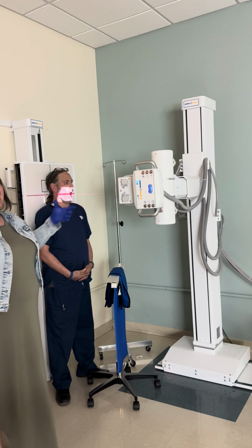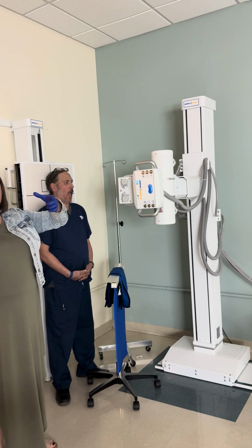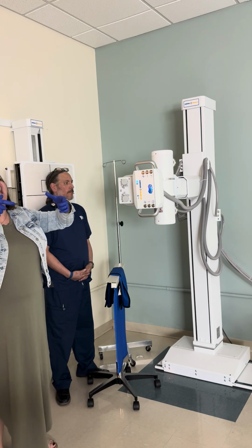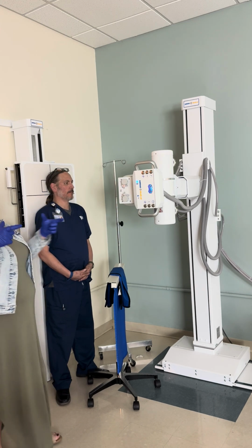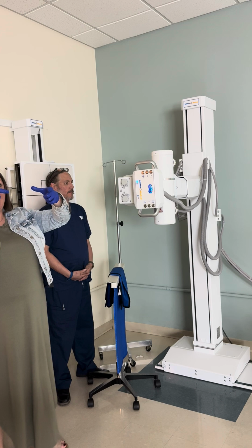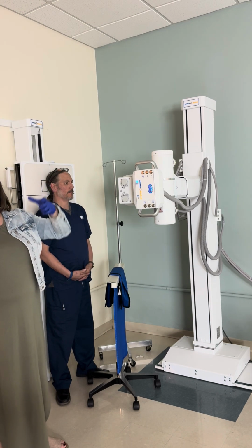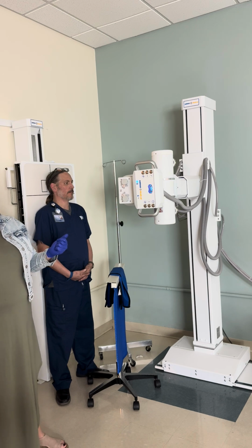The reason I keep my hands on the face while I have them open their mouth is because if not, a lot of people tend to go and tip the head back when they open their mouth. So hold their head like that, have them open their jaw as much as they can, and then you're still keeping everything in line. Does that make sense?